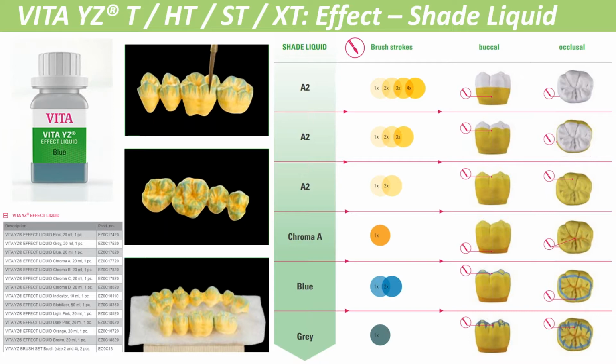But the light that does come through, if we can get some of that stain internally, it's going to give us a little bit more natural of a look. So these are some different techniques that we can do to add some of that color internally.